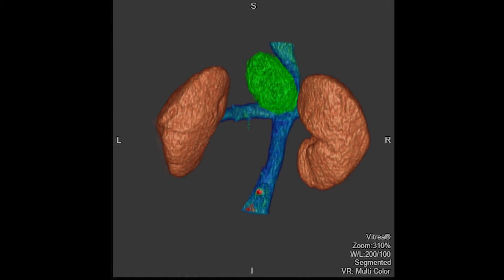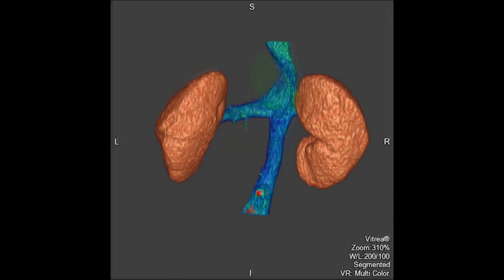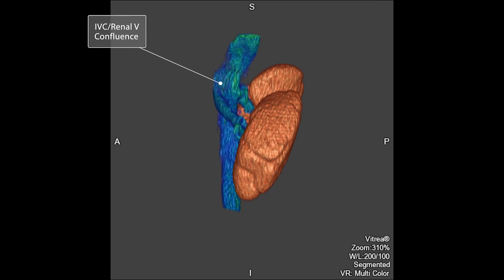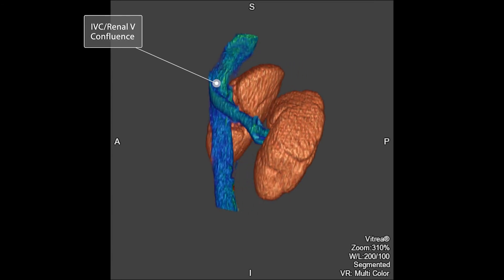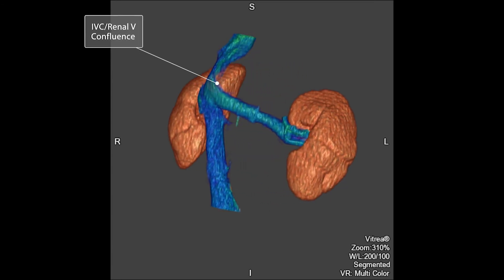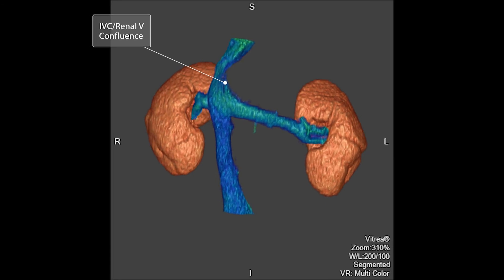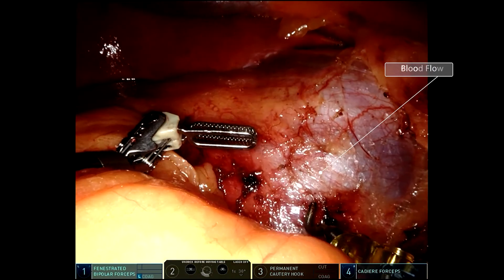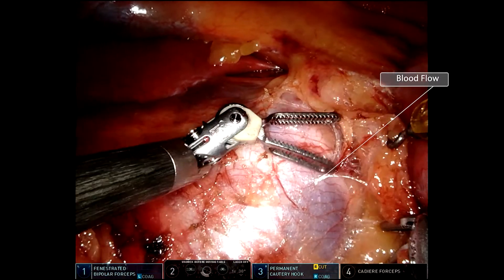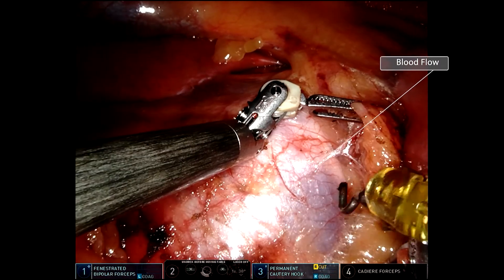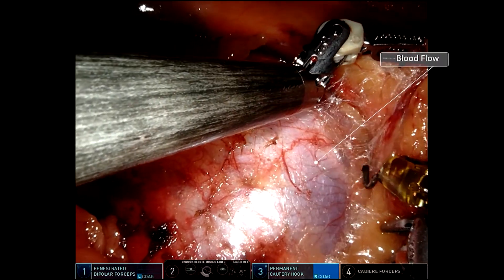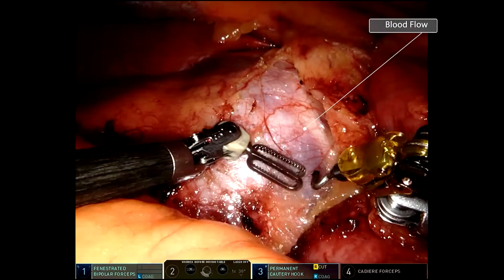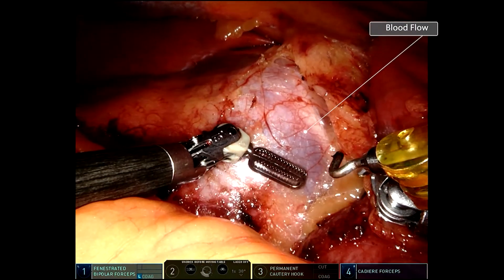After removing the tumor, one can see the tumor compressed on the junction between IVC and the renal vein so hard that it created an indentation. The real-life video clip demonstrated the IVC was stretched by the tumor so much that one can easily see the flow change in the IVC back and forth like tide.